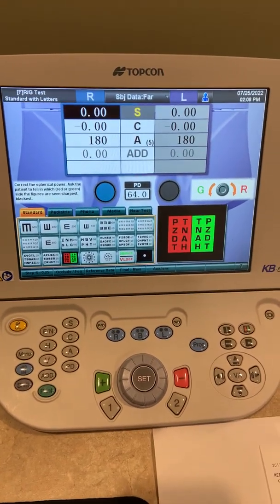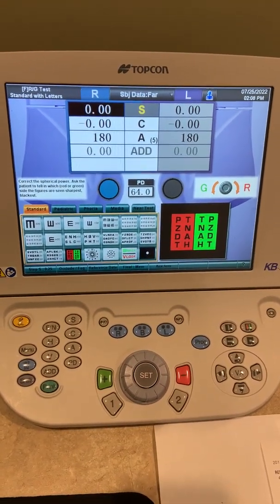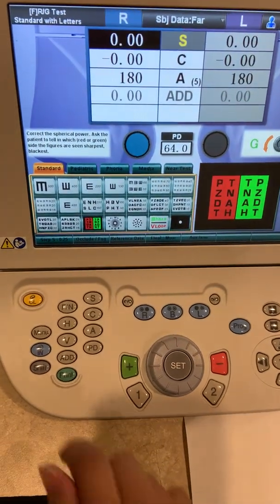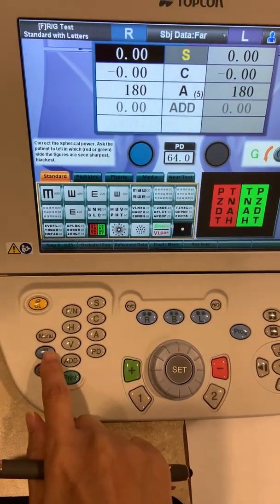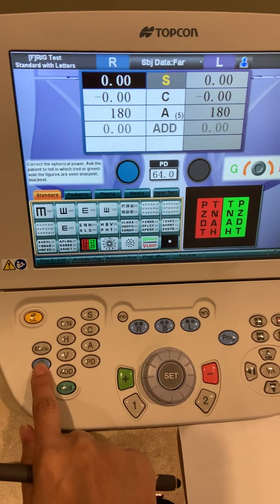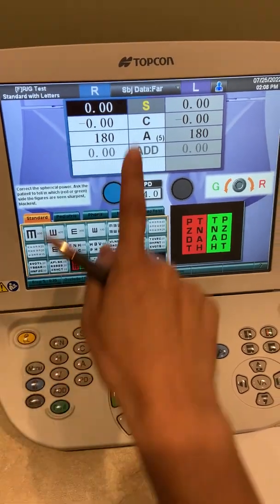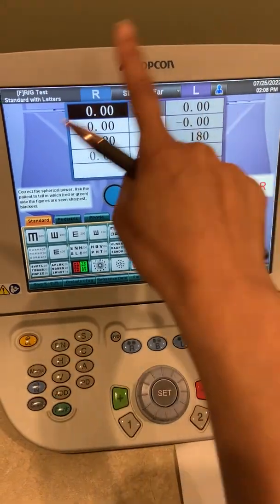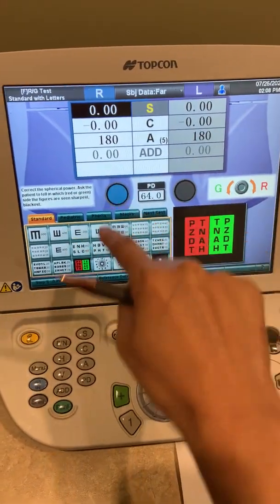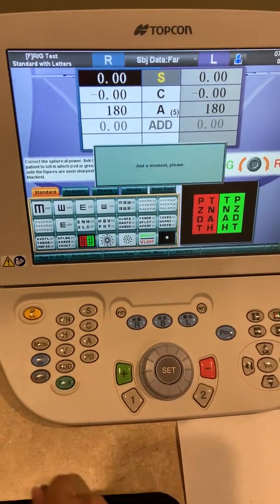This tutorial is for the Topcon CV5000. In order to get started, let's input some information by pressing this blue button. If needed, you can press clear if there is information already on the screen, but for now we'll press in.